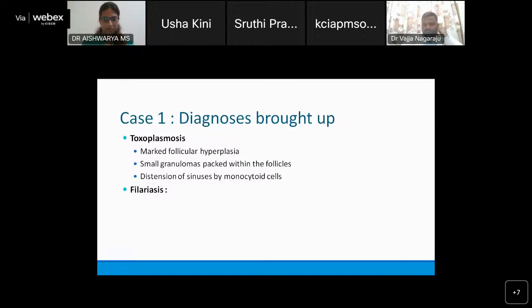Someone said filariasis. Do you think that it could be filariasis? Maybe those structures which you figured out, they said maybe they are filarial parasites. Do you think so? No, ma'am. I couldn't see the proper sheath and the granules present in the filaria.